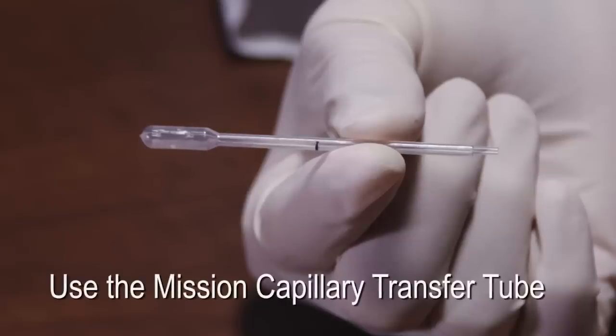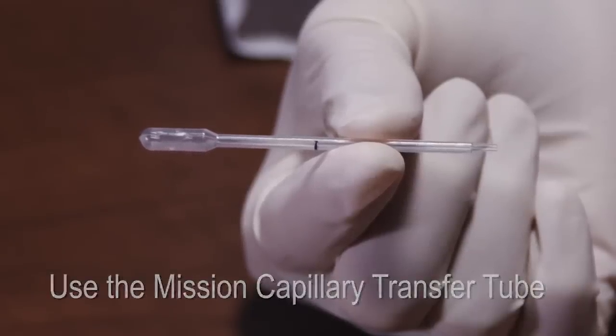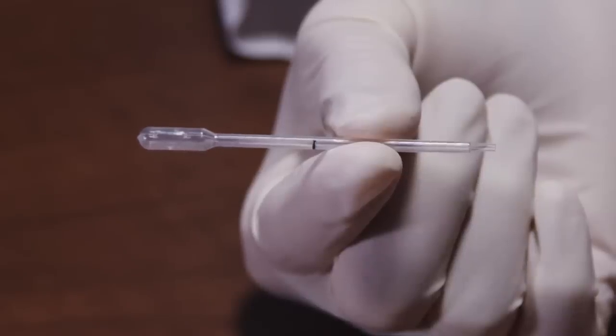The mission capillary transfer tube helps to draw the correct amount of blood. The transfer tube also makes it easier to apply the blood sample to the test strip or cartridge.